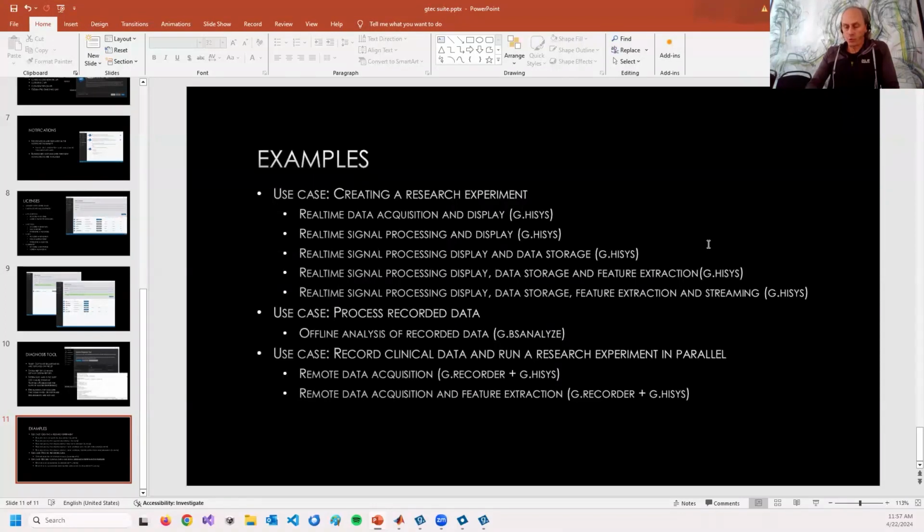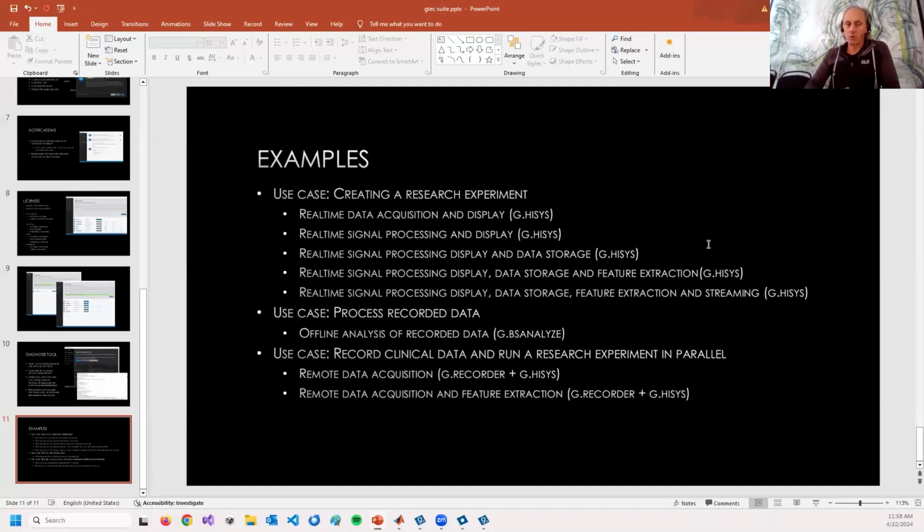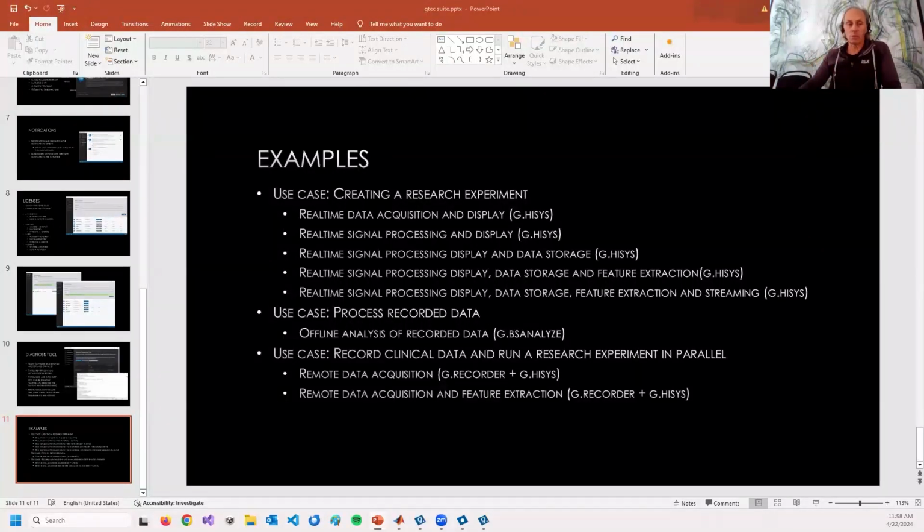Ushman is asking, how do you see the usage of capacitive EEG electrodes? Because then you don't need the galvanic connection. Could this be more feasible? I'm not an expert in this case, so maybe I can hand over to you, Christoph. So up to now, these capacitive EEG sensors are pretty big, and they have, of course, the problem that you get a lot of interference from things in the surroundings. This is much better to handle with electrodes which are in close contact with the brain via the electrode gel. So this interference is a big problem, and nowadays there is also still the size of these capacitive sensors. But this could improve, but the shielding must be improved much more.